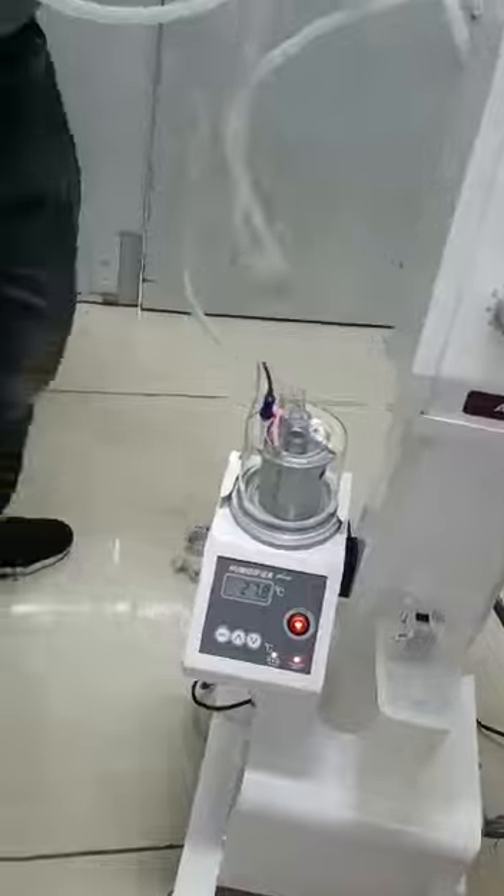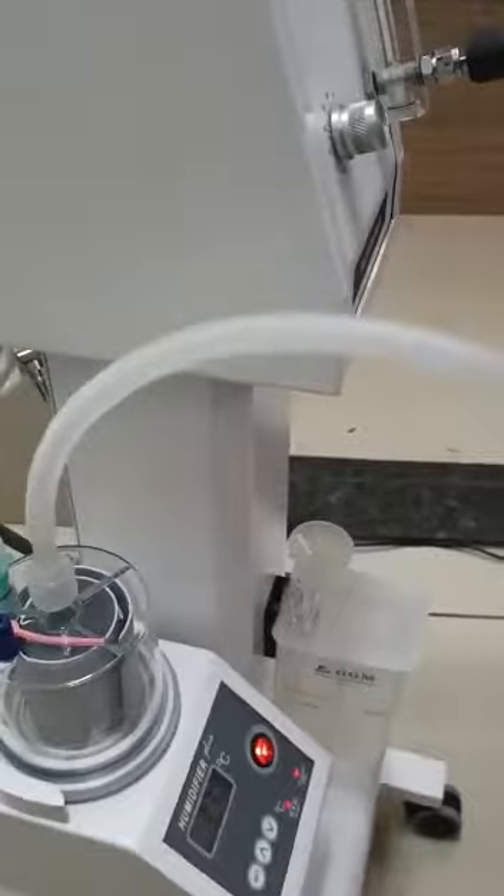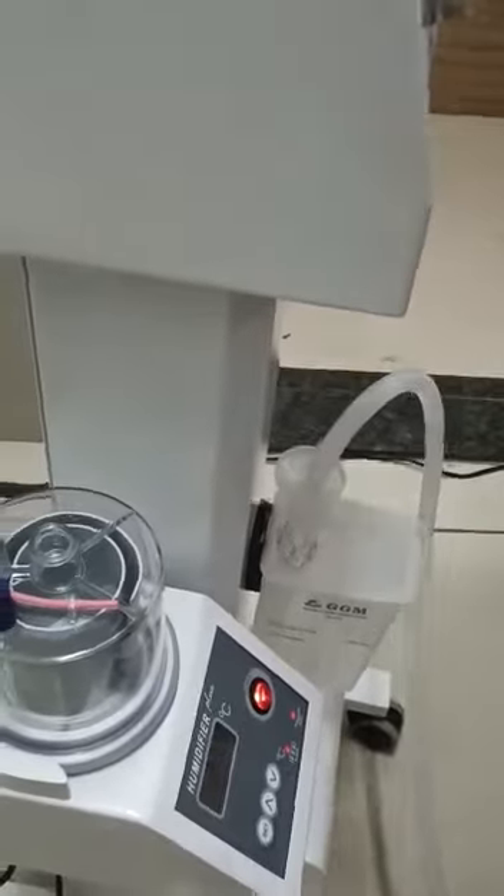Now to fit the circuit: one connection here, one connection here, one connection will go here and through. From the patient it will come here, and the one with heated wire will go here. And this is the heated wire connector, which you have to connect.